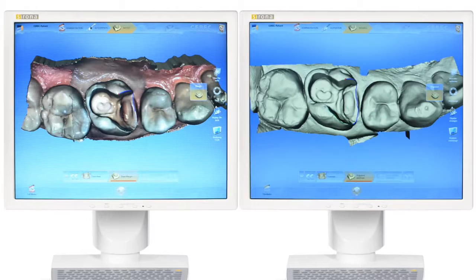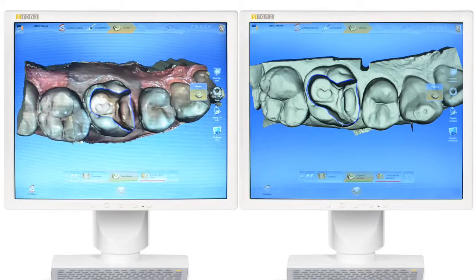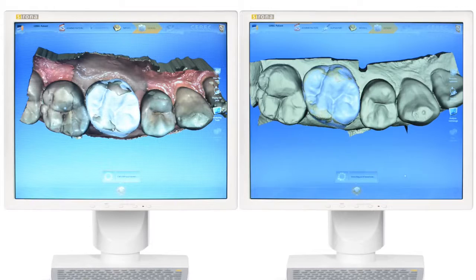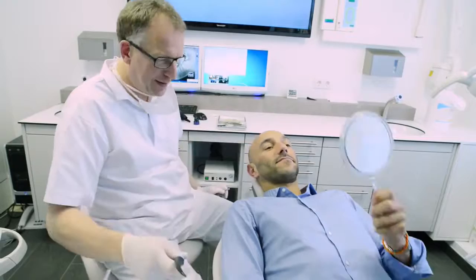After scanning is complete, the workflow for both cameras is essentially very similar. Virtual models created from Omnicam images are full color, an advantage for patient communication. With a single click, the biogeneric proposal with natural occlusal contacts is automatically calculated. Both cameras are easy to use and provide highly precise clinical results. You have the choice between two absolutely first-class camera systems.